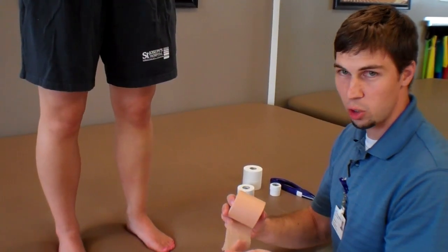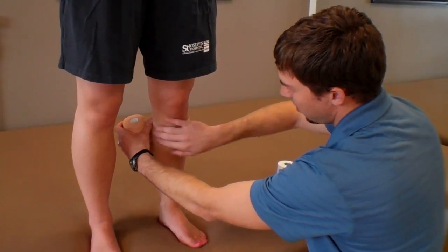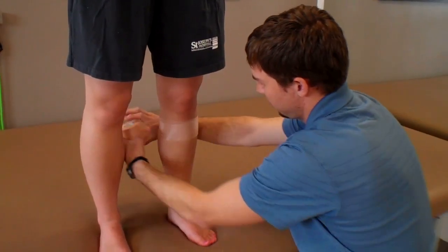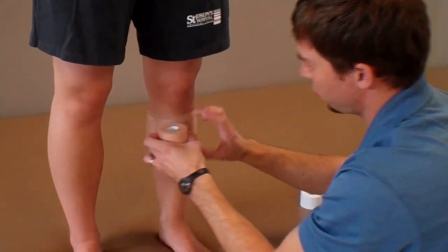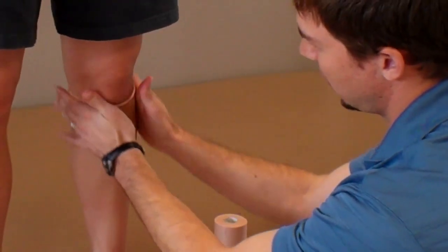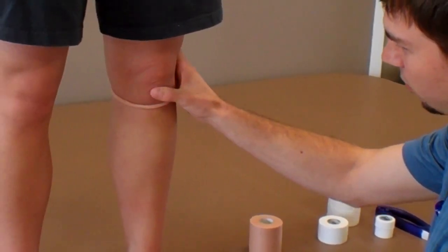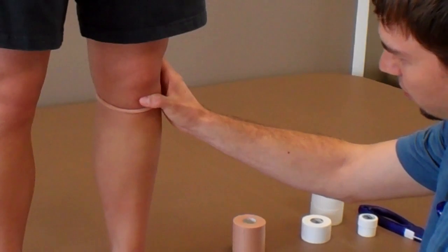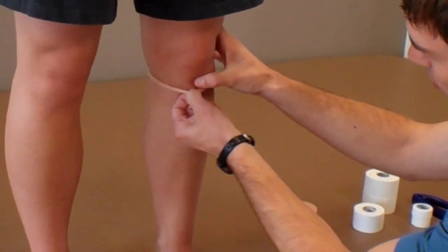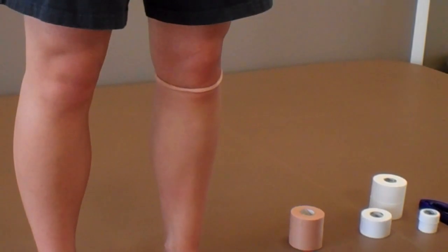The first technique is you can just use pre-wrap. What you would do is start below the kneecap and apply two or three circles around the knee, stop it there, and roll it up. That's going to make essentially a Cho-Pat strap. You're going to position it so the bottom of the kneecap is right over the patellar tendon. And that's one technique.